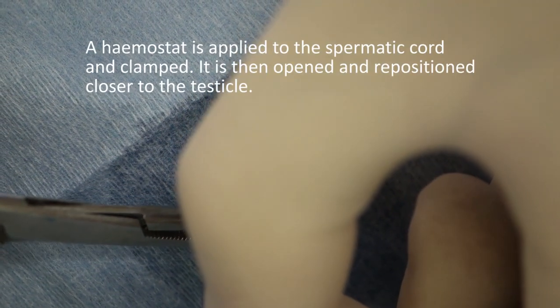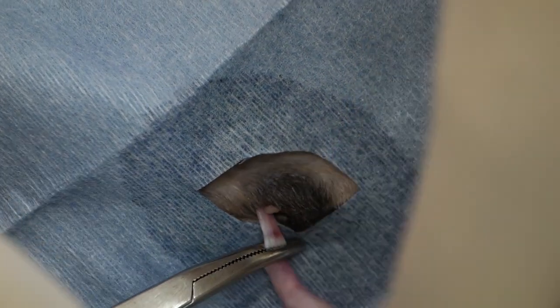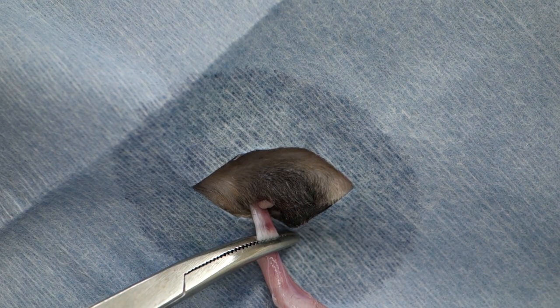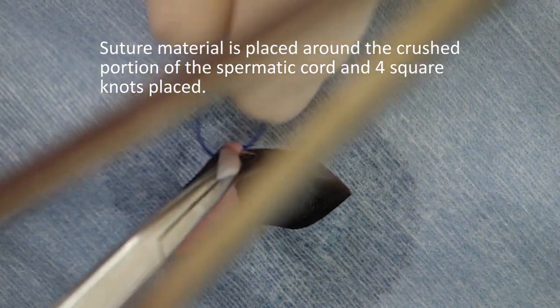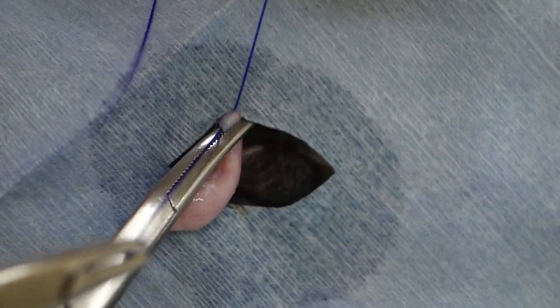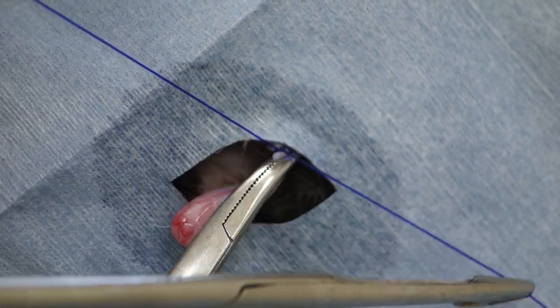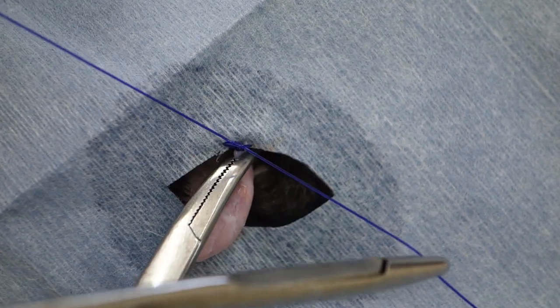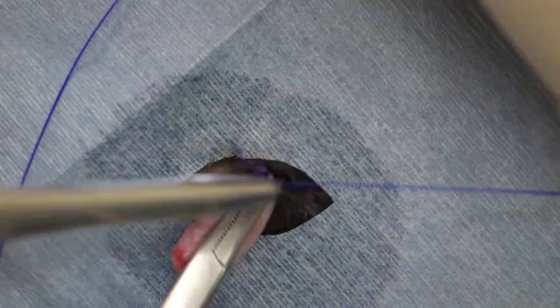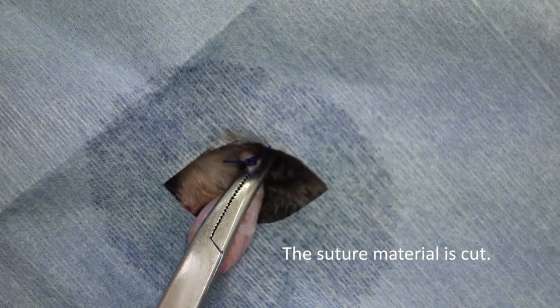Next we crush the spermatic cord with a haemostat, then we move our haemostat closer to the testicle and use the crush to tie our ligature. Here we're performing an instrument tie with four square knots. It's perhaps a little bit of a luxury to be using instruments — often people will just use a piece of suture material and a scalpel blade. We cut our absorbable suture material.